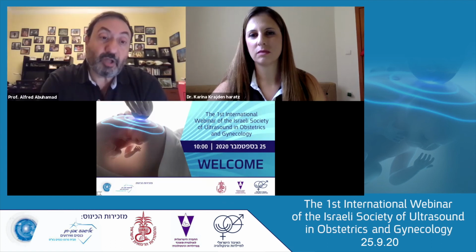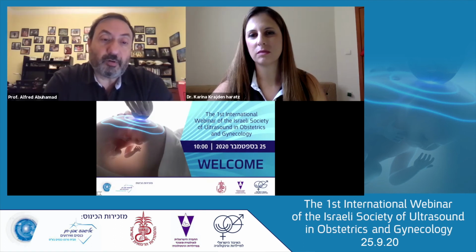Use the transabdominal approach. If you optimize your ultrasound image, you are able to really do good cardiac screening, but also good fetal malformation screening in the first trimester from 12 weeks on. And thirdly, use color Doppler in the evaluation.